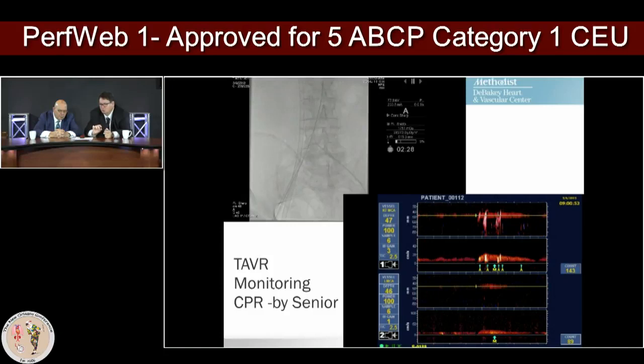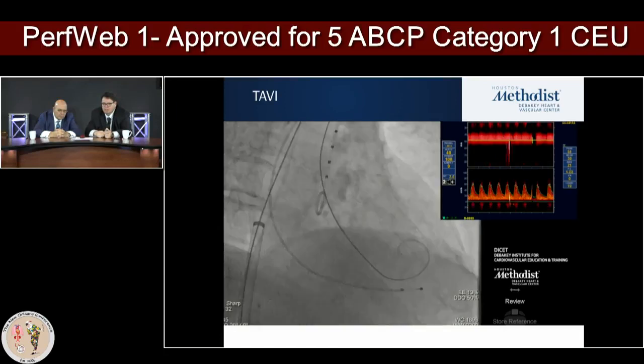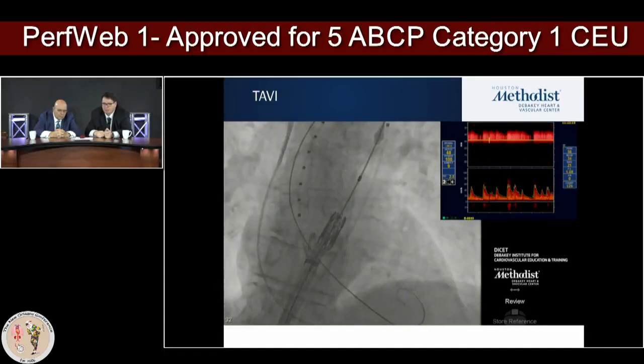And why are we de-airing? Look at the slow start on the perfusion, how we really minimize the air. So I think that's the immediate feedback, saying, hey, that was too fast, that was too much air, and try to slow it. I think this is a perfect example of how you can direct your blood flow. I think I'm going to skip this one, because we're running out of time.